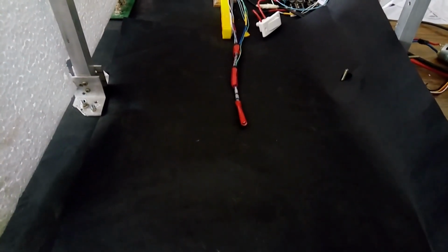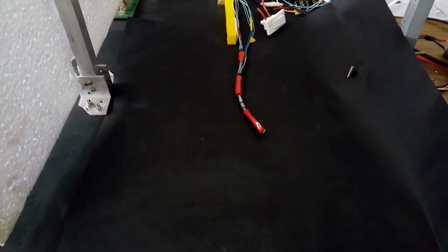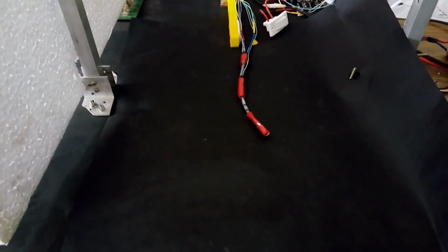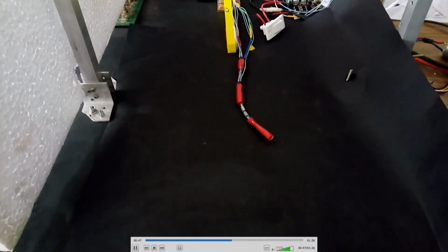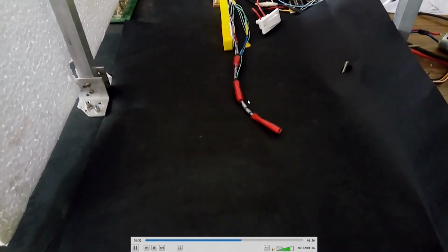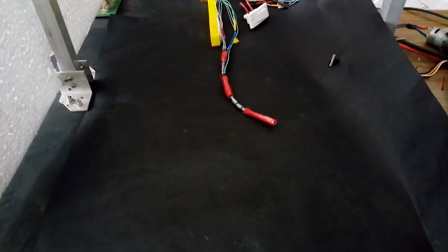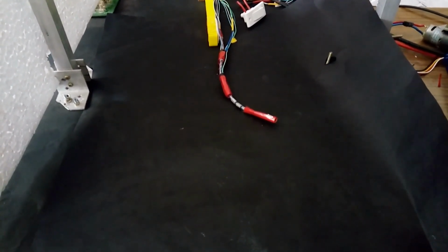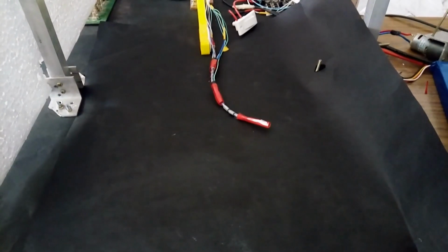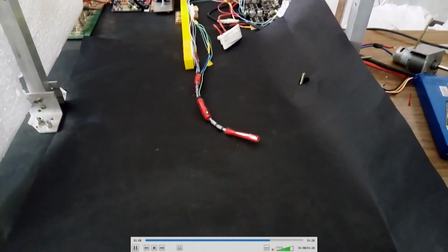And here is the experimental setup, where on the top we have attached the vision system, vertically mounted to capture the top view of this system. You can see that the rack and pinion system here is pushing the needle forward, and the SMA actuators are getting the current, due to which they contract. The bending of the needle is happening here, so that the curved trajectory can be traced by the needling system.